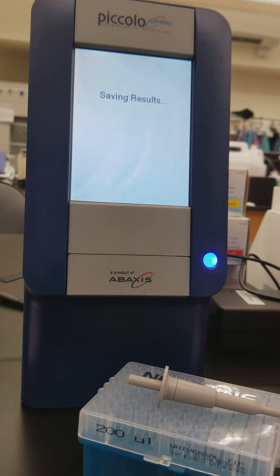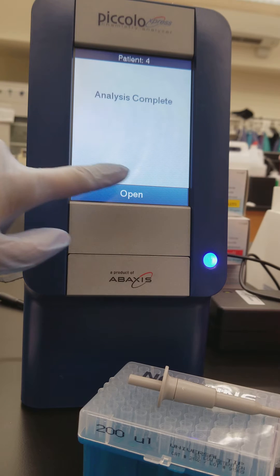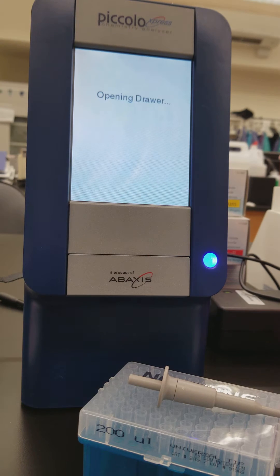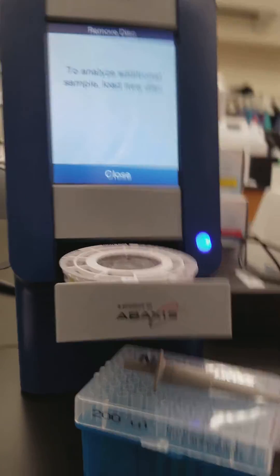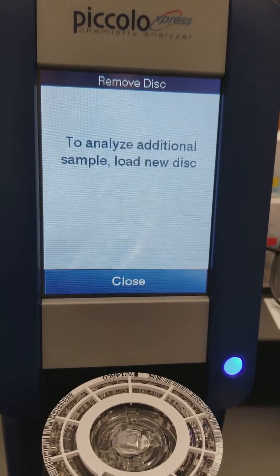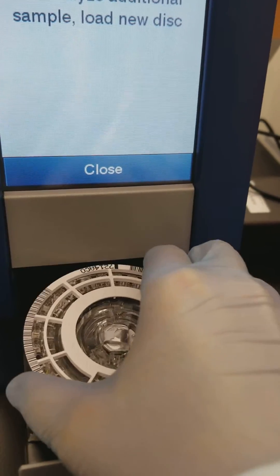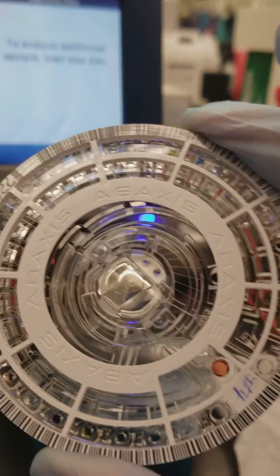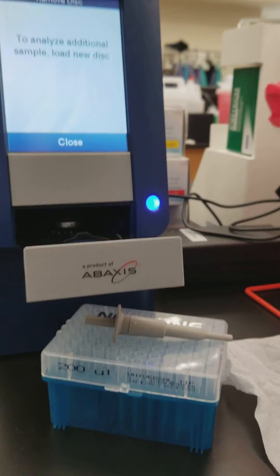We're at the end. It just said it's saving the results, and now the analysis is complete. I open the drawer to get the specimen out. It says to analyze additional sample, load a new disc. I'm going to take the old one out. Notice all the different colors, which we'll look at in just a second.